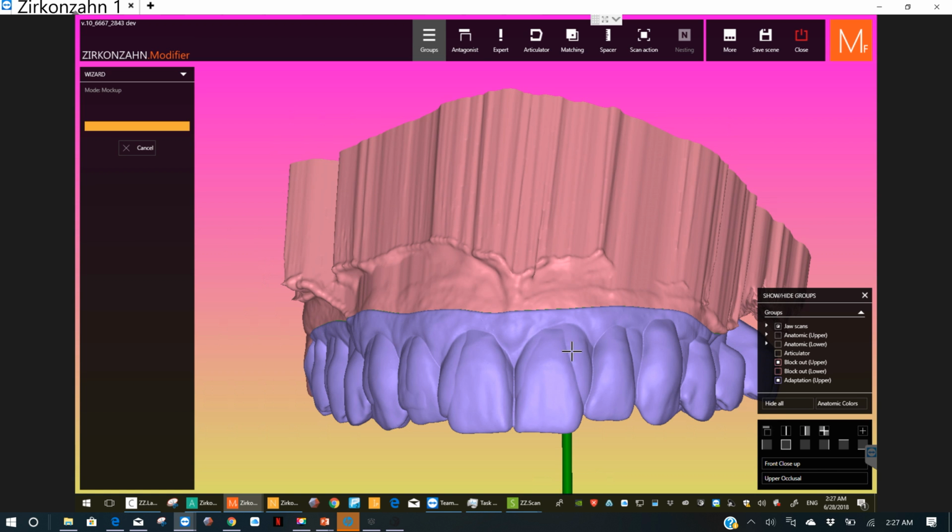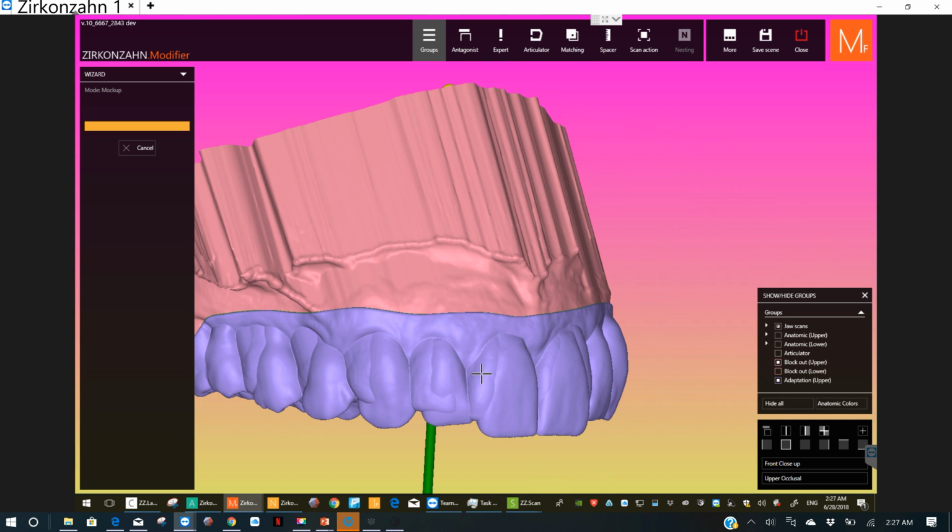So there it is, and we could probably actually remove those areas a little bit if we decided to glue this thing in. Once it's in, actually cut into their tooth a little bit so we can see where their real teeth should be.